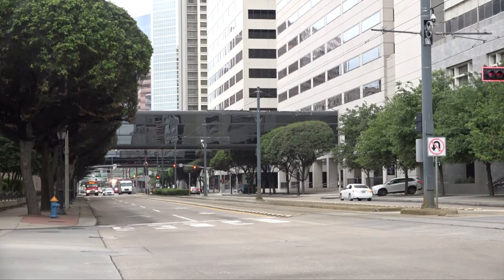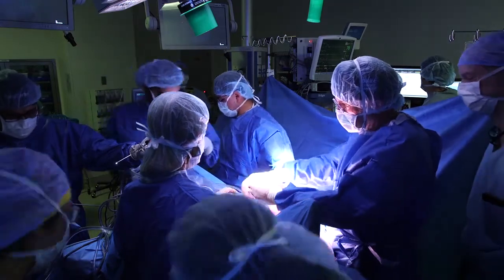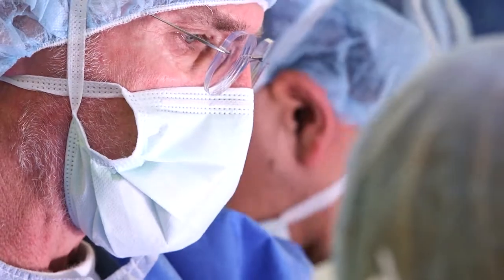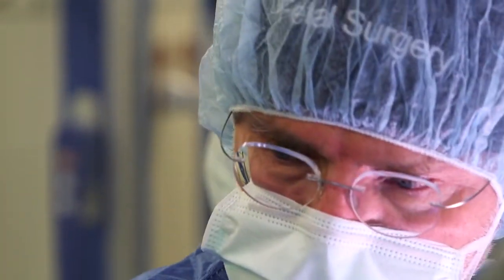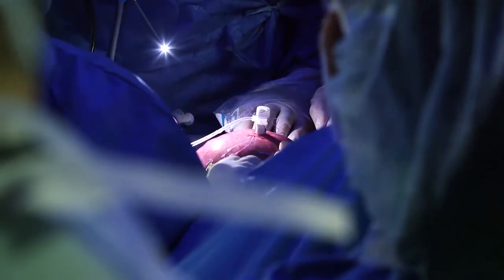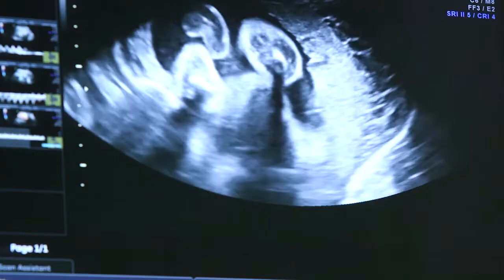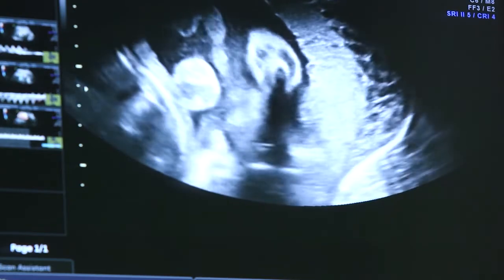Pioneered by a team at Texas Children's in 2014, led by Dr. Michael Belfort, obstetrician-in-chief at Texas Children's Pavilion for Women and the chairman of the Department of Obstetrics and Gynecology at Baylor College of Medicine, the world's first fetoscopic technique allows surgeons to access the fetal spine in a minimally invasive way to repair a neural tube defect.